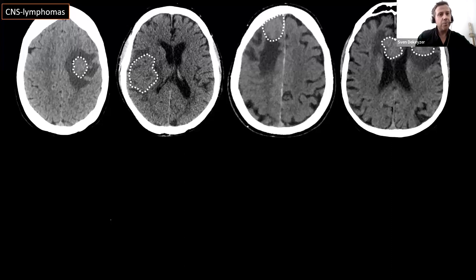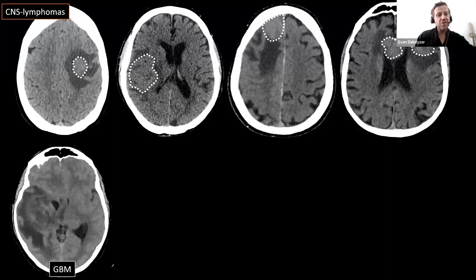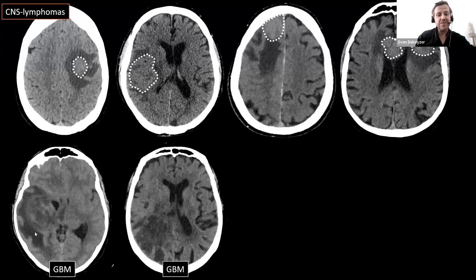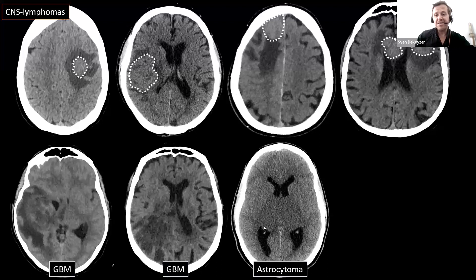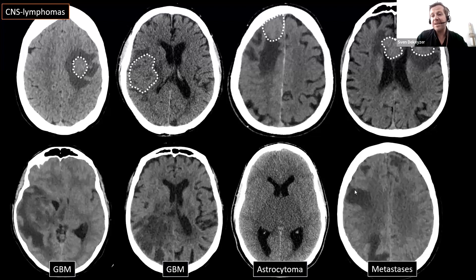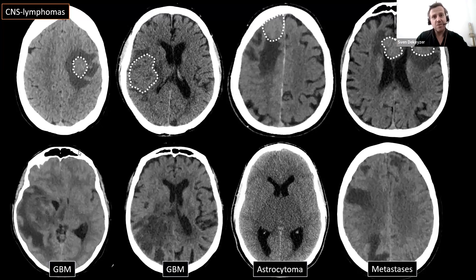Let's compare with other frequent tumors. Glioblastomas are mainly hypodense, sometimes with hemorrhagic dense components. A bithalamic astrocytoma shows swollen hypodense thalami. Cerebral metastasis may only show edema on CT without visible tumor. In contrast, the fact that a CNS lymphoma is relatively dense on unenhanced CT is a very characteristic finding.